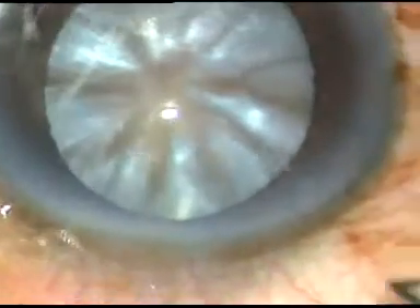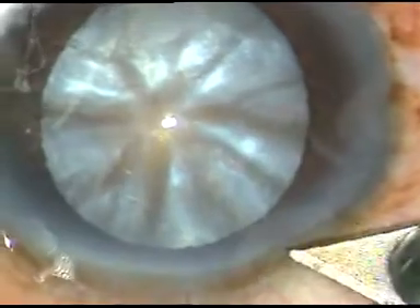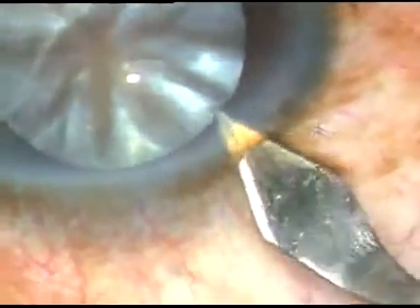This is the main incision at around 11 o'clock with a 2.8 mm keratome. This is a posterior limbal incision.